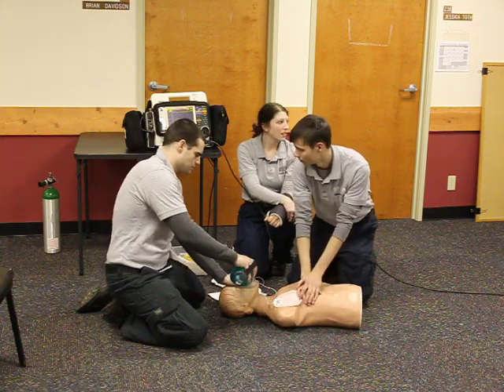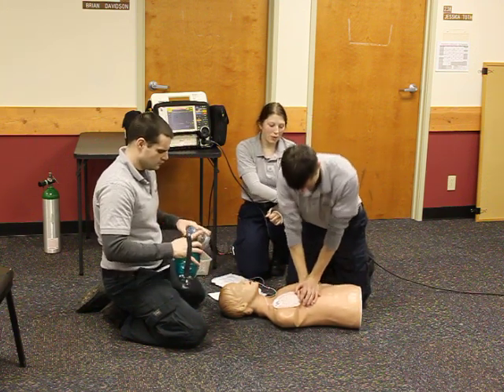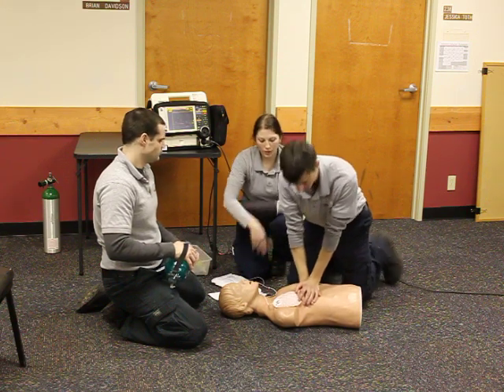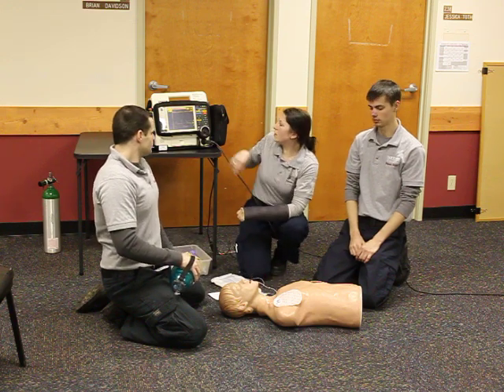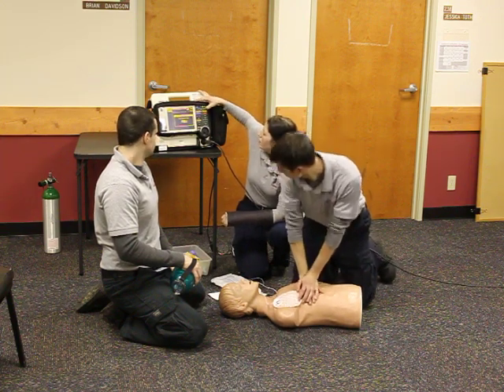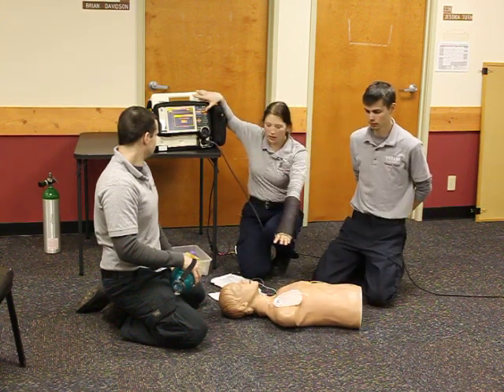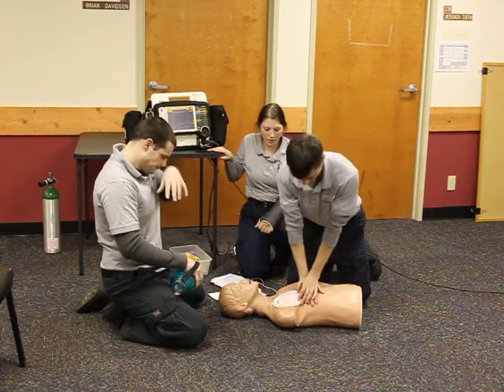That's your rhythm. At this time I'm going to consider intubation. Push another milligram of epinephrine, 1 to 10,000 IV. After 2 minutes, we're going to stop and feel for a pulse and assess the rhythm. No pulse. I notice VFib, so we're going to defibrillate the patient. Since it is a biphasic monitor, we're going to set it to 200 joules. Charge it, and as soon as it's ready, clear. I'm clear, you're clear. Shock. Continue CPR for another 2 minutes.